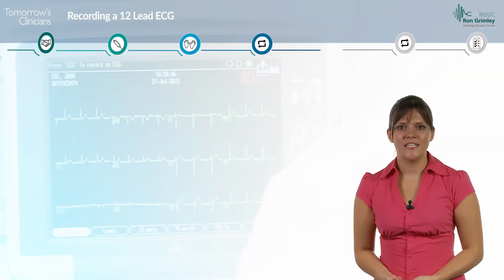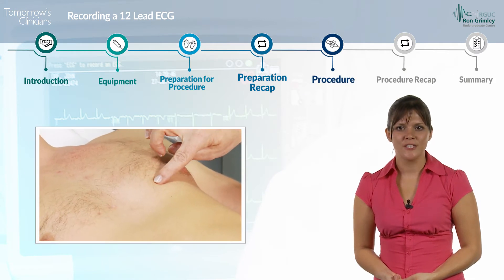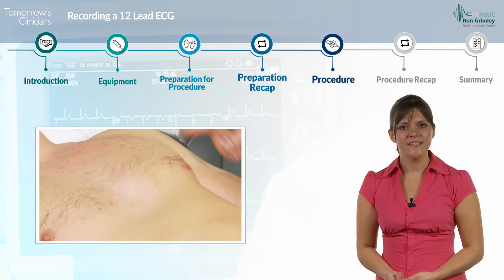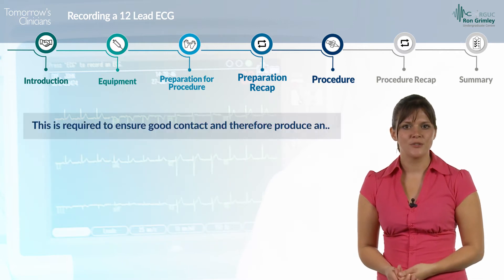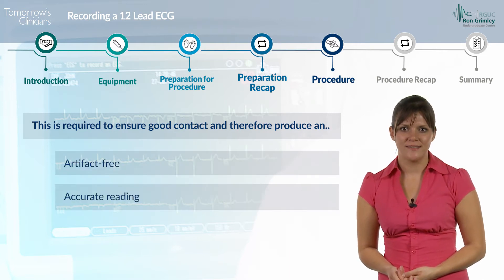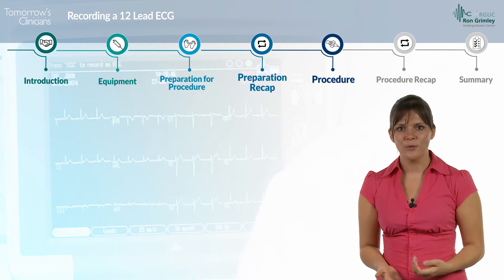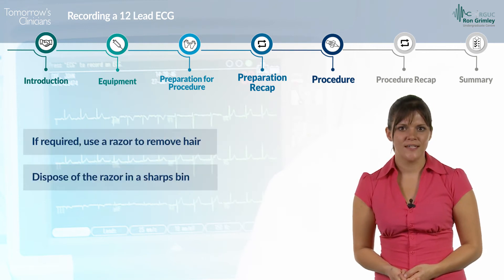You are now ready to begin the procedure. Identify the site of attachments for the electrodes accurately and at these sites prepare the skin. This is required to ensure good contact and therefore produce an artefact-free and accurate ECG trace. If required, use a razor to remove hair and dispose of the razor in a sharps bin.